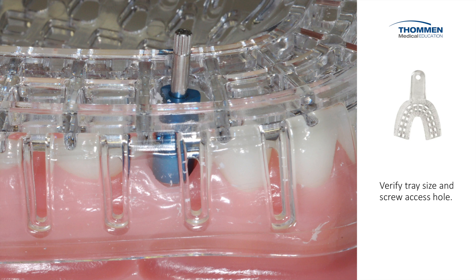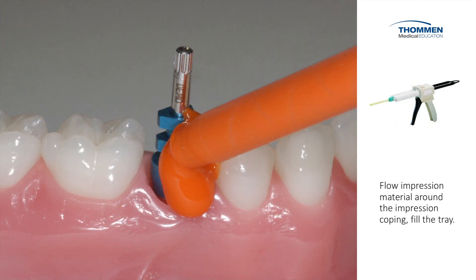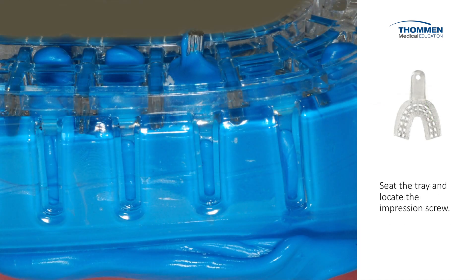The screw head needs to be tall enough to stick up so that we can actually remove it once the impression is taken. We use flowable impression material around the coping and then we fill the tray with a regular body impression material. We place the tray by locating the screw channel.